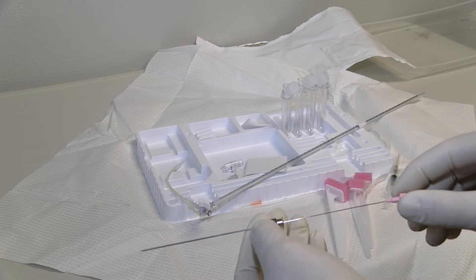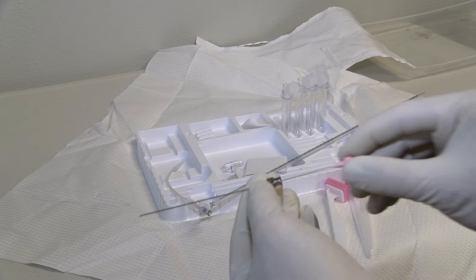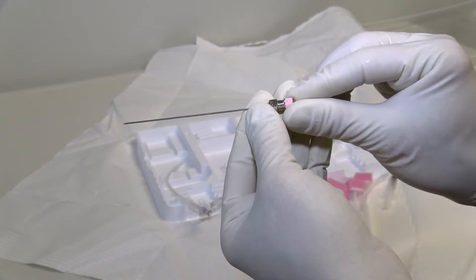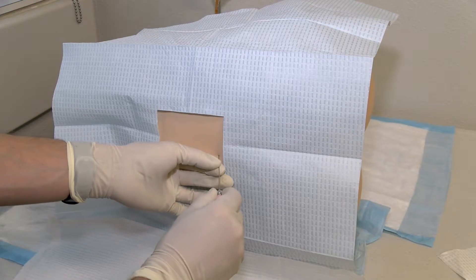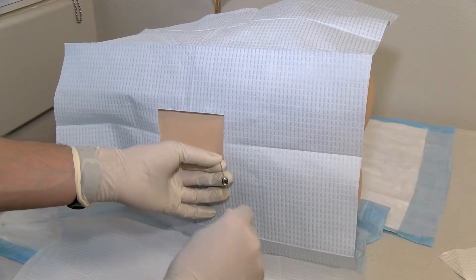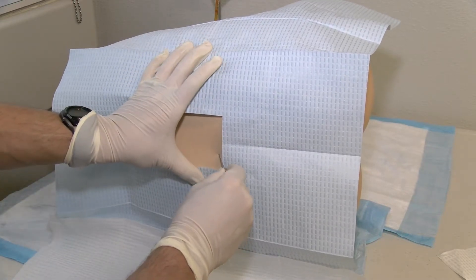As you prepare to insert the spinal needle, be sure to review the orientation of the needle hub and the bevel. The direction of the bevel is denoted by a notch or bump at the needle hub. Ensure that any time you advance or withdraw the needle, the hub is engaged with the stylet, which will occlude the needle tip. Correct orientation of the bevel and use of the stylet minimizes tearing of the meninges during insertion and helps the opening to heal following the procedure. The stylet will also prevent a small nerve fiber from being pulled outward from the spinal canal upon removal.